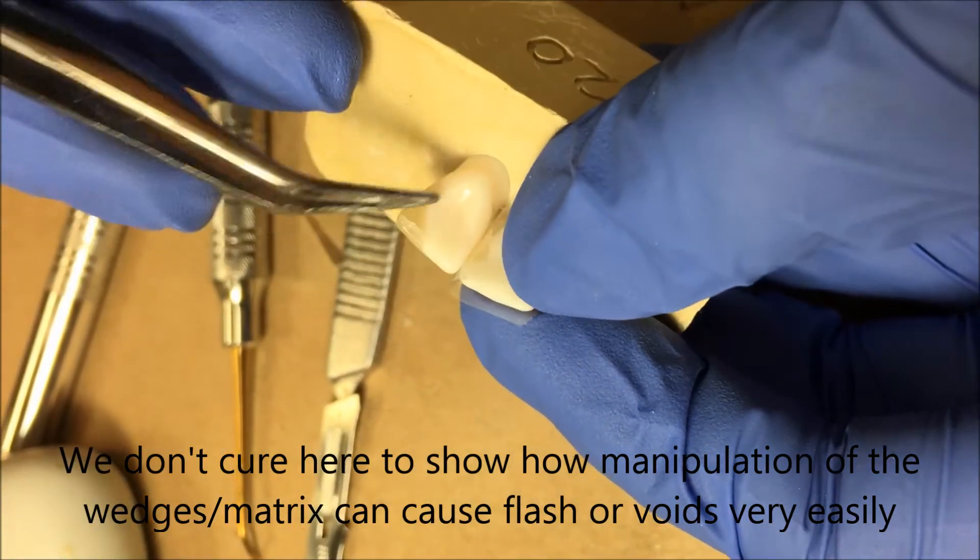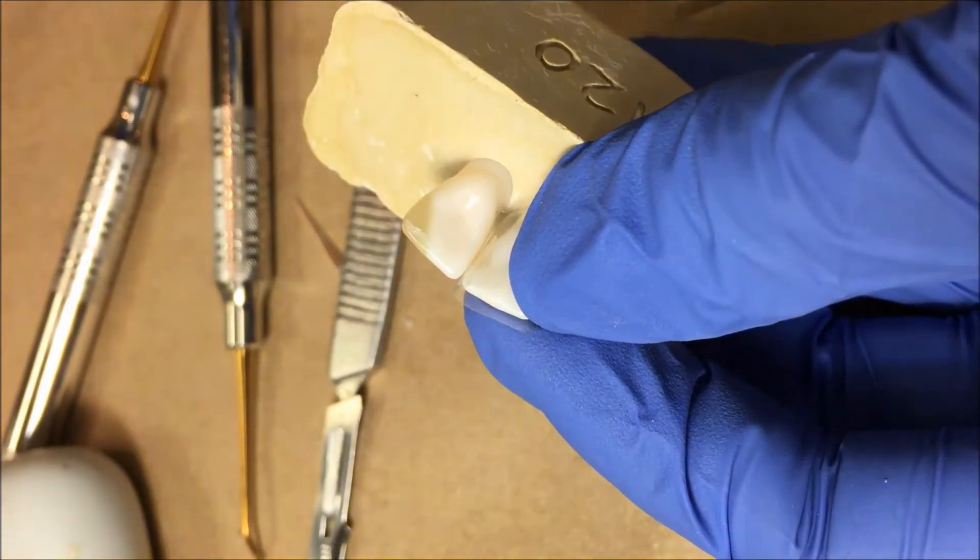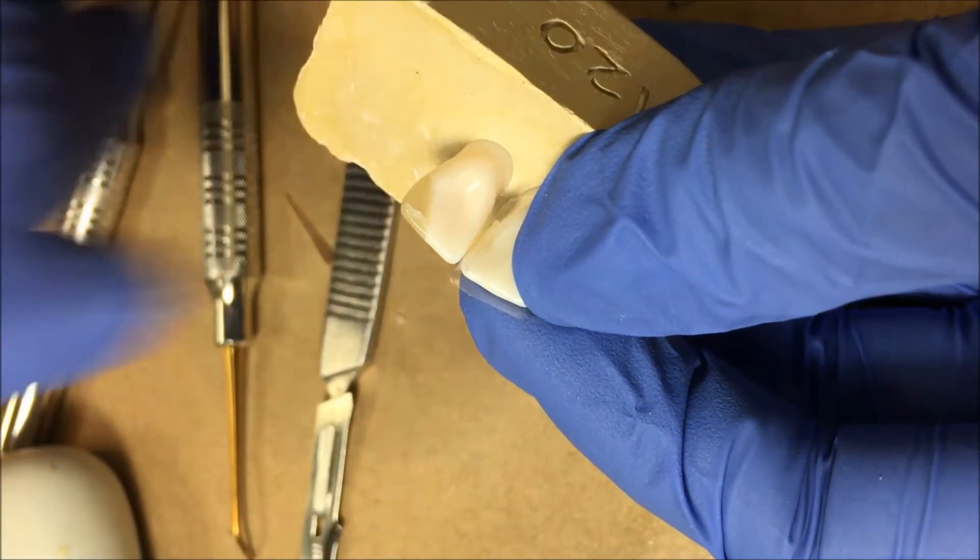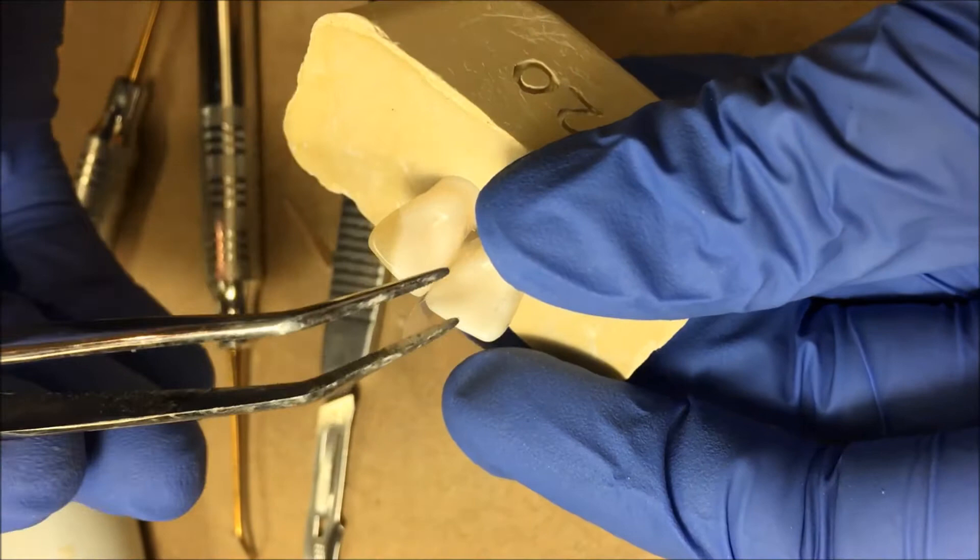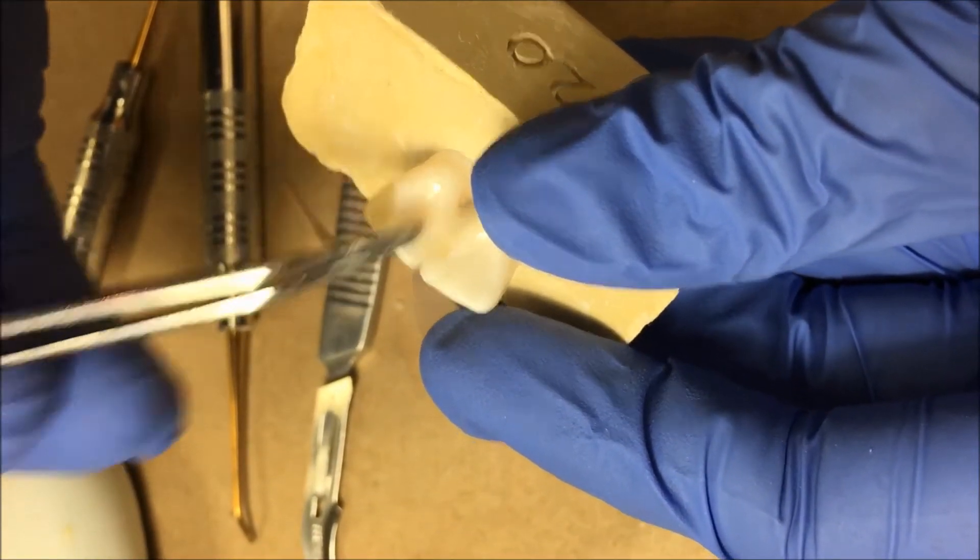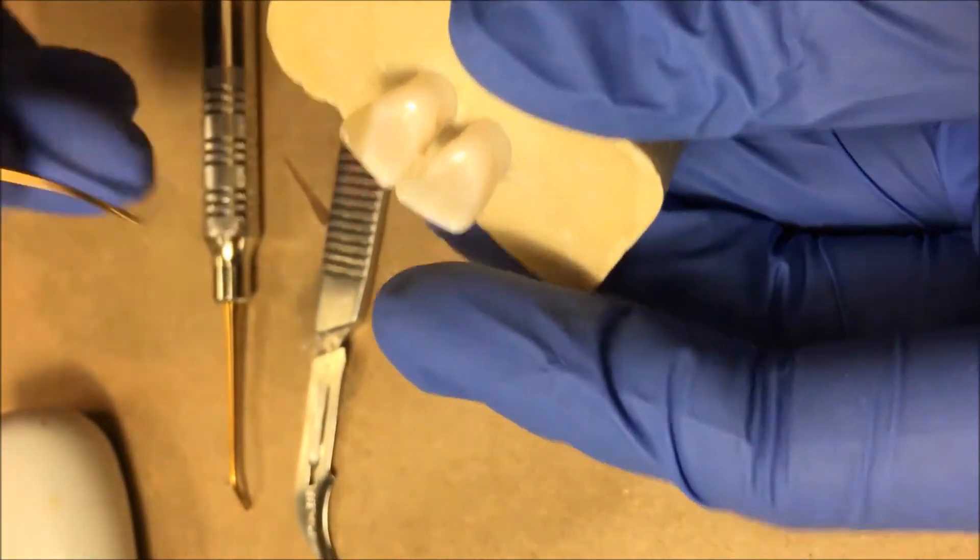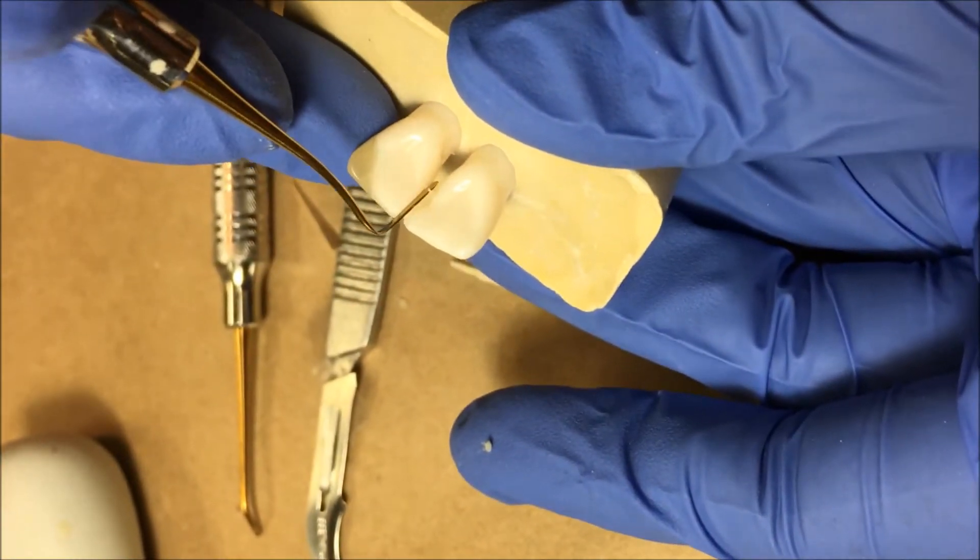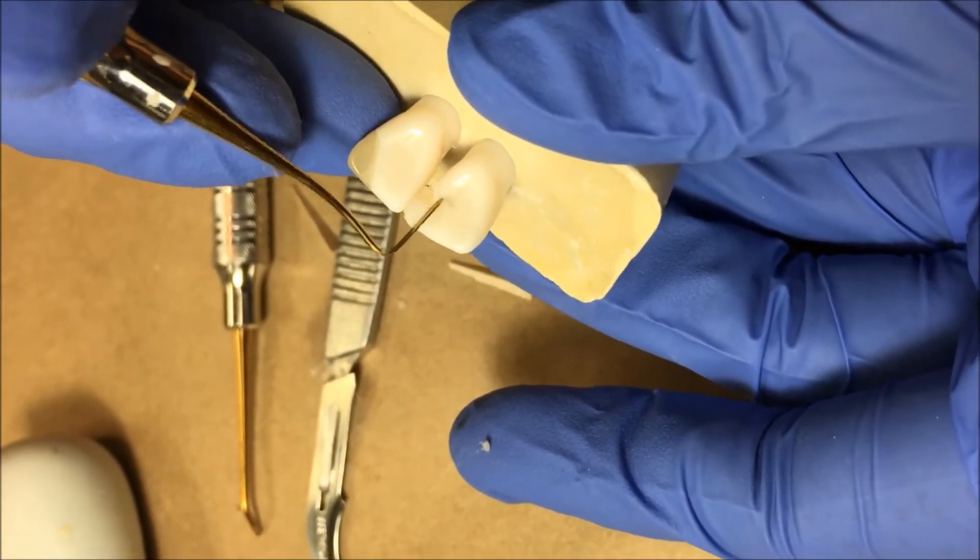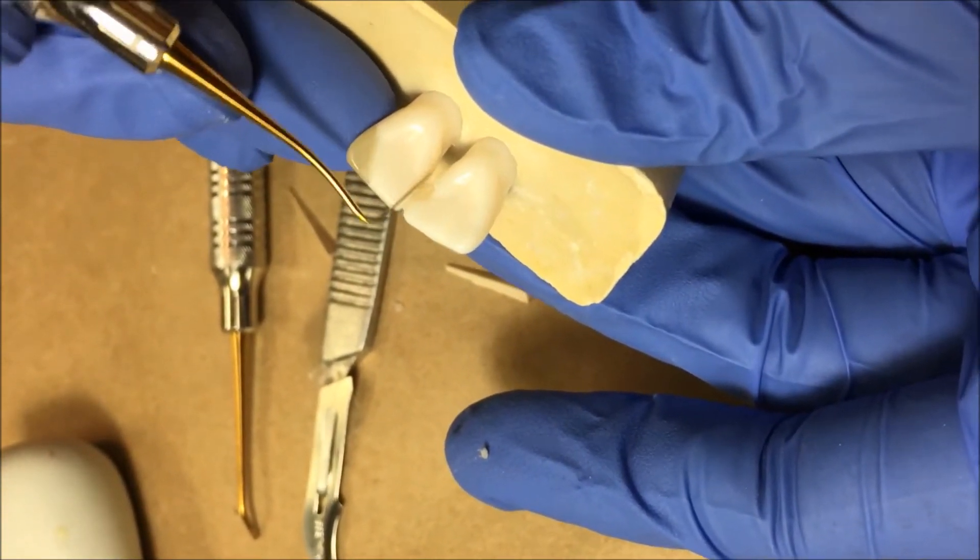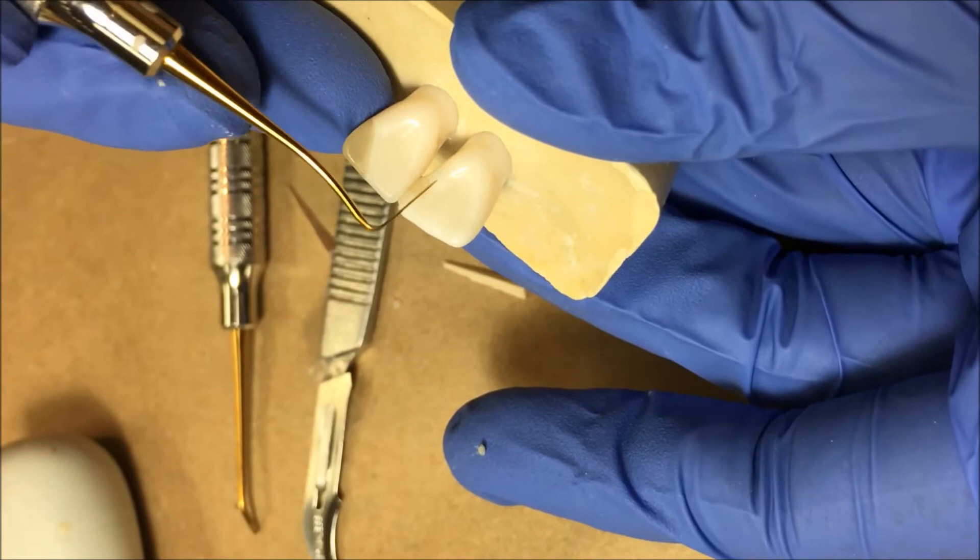So had I cured this and now of course I would have a nice little overhang here you can all see that actually on the camera. If I cure that it won't stick anymore but in this point at this case it's going to stick. So I'm going to try and see if I can whip that out of there as quickly as I can. The more you move that matrix band around the more you're going to have stickiness. So as we talk about the time crappiness continuum mess with it a little bit but don't mess with it too much.